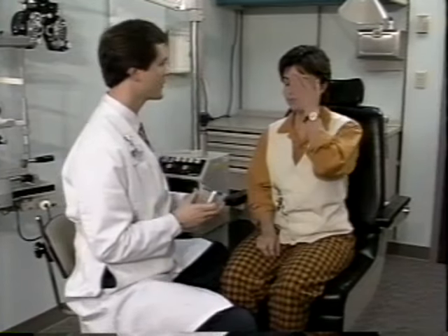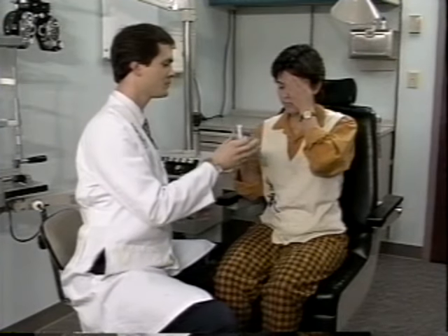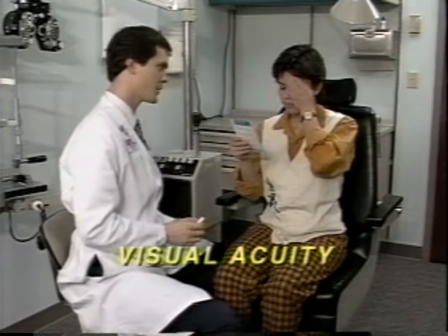Now I'll do the exam in sequence. All you need is your near card, a penlight, and your direct ophthalmoscope. Let's check your vision first. Cover your left eye with your hand. Hold this, please. What's the smallest line of numbers that you can read?